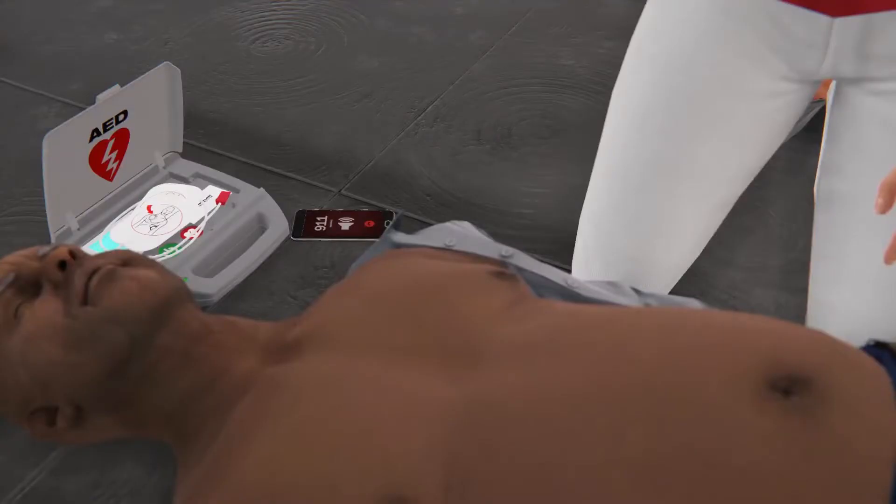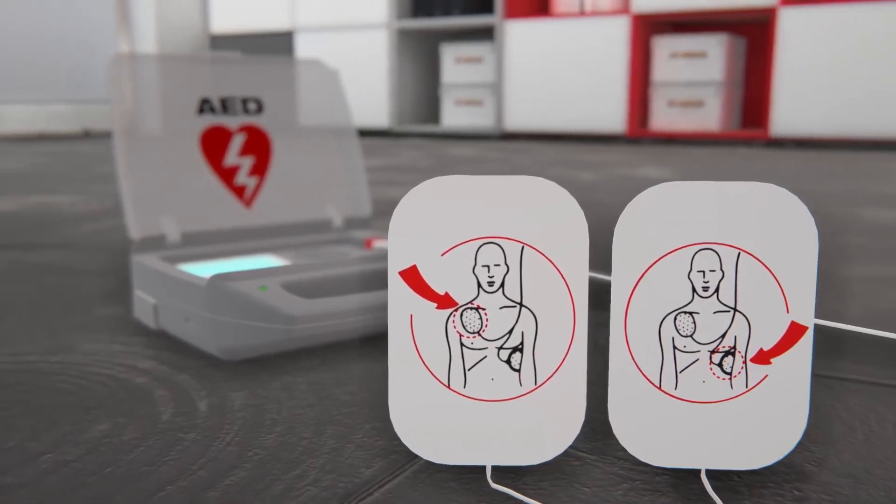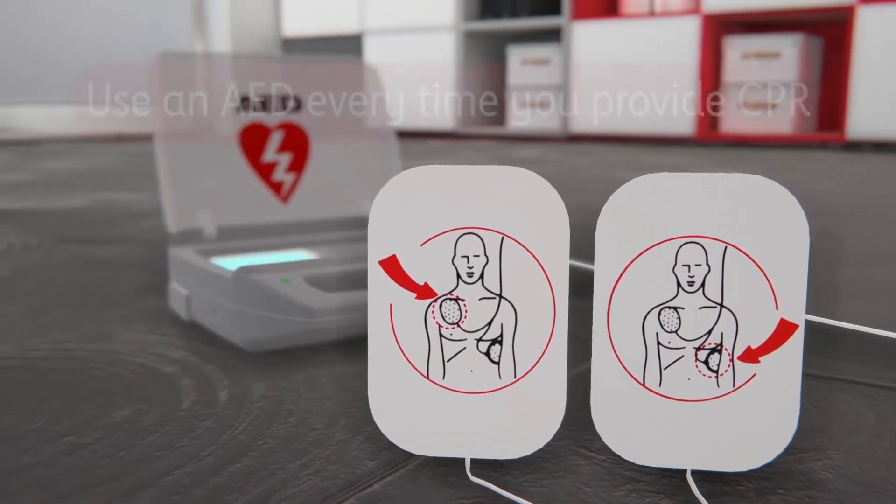You must remove all clothes that cover the chest, as AED pads must not be placed over any clothing or jewelry. CPR combined with using an AED — automated external defibrillator — provides the best chance of saving a life.